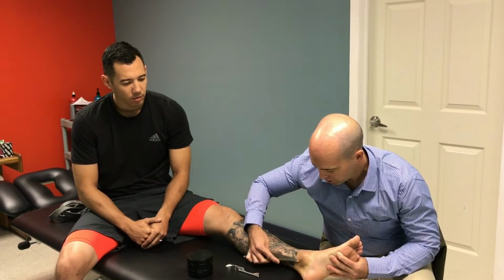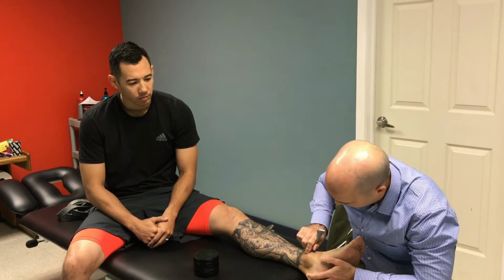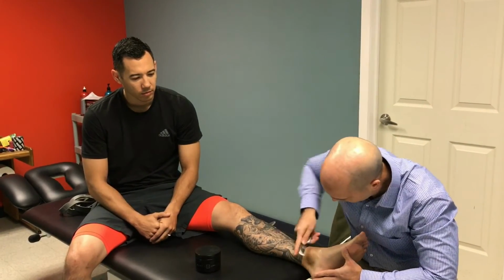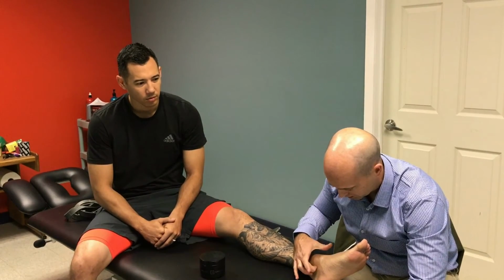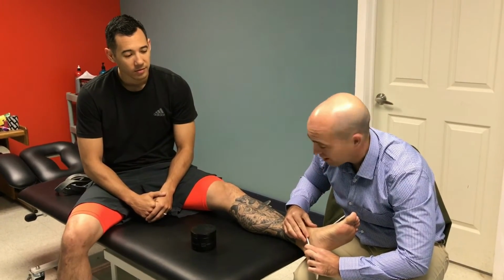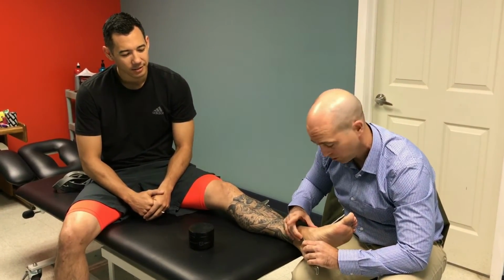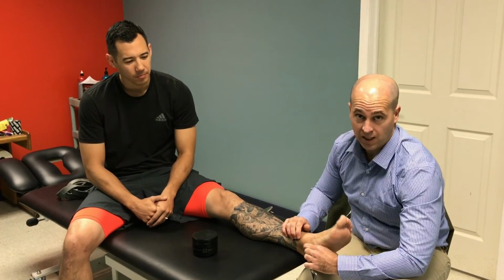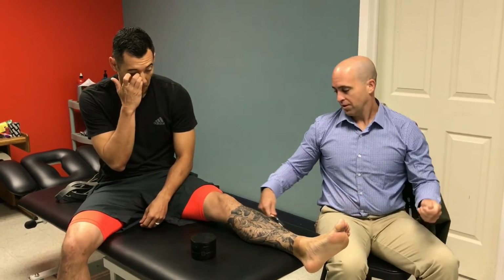What we eventually ended up doing, we took the Captain Hook tool, we cleared the path. I'm giving you the quick and dirty version here. We went around here, cleared everything up. Then we loosened up the tissues in between the medial malleolus and the flexors. We got in here and went back and forth just a little bit. It's a little uncomfortable, but not too bad. Once we cleared up in here, we pinned the tissue down, not the flexors, and had Justin move your ankles up and back. Just like that. We went in all different directions with this as well. That seemed to help a little bit as well.